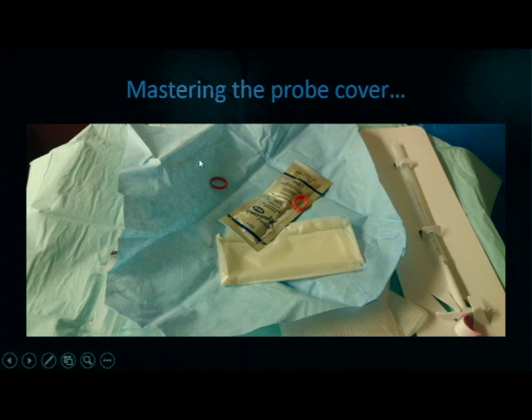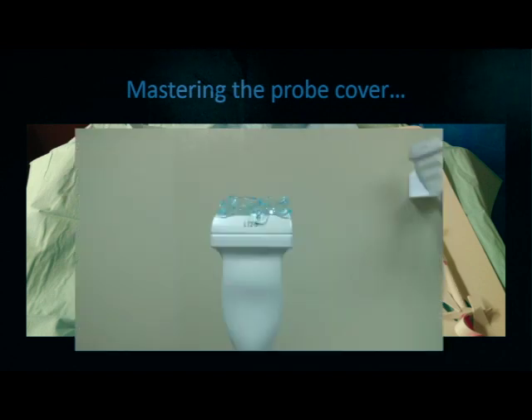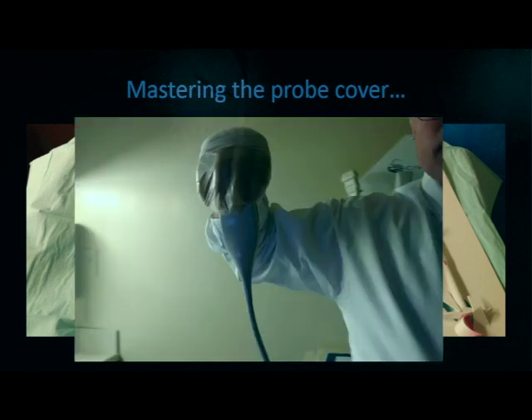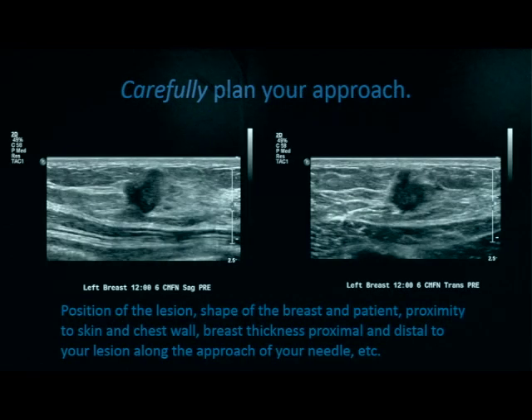When you have the probe cover, these are the basic things as you unfold the sterile wrap. Here is the plastic probe cover, some sterile gel, as well as two rubber bands. Be sure to put your sterile glove through the probe cover, place gel on top of the probe, and then grab the top of the probe as the ultrasound technologist hands it to you and slide the sheet over the cover in a sterile fashion. Attach your two rubber bands and you're ready to go.